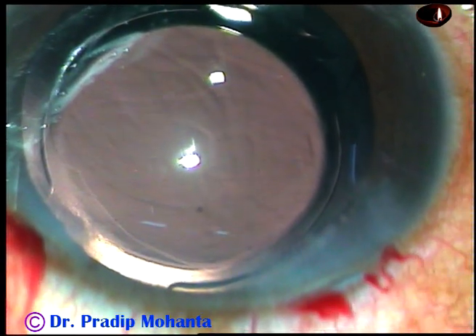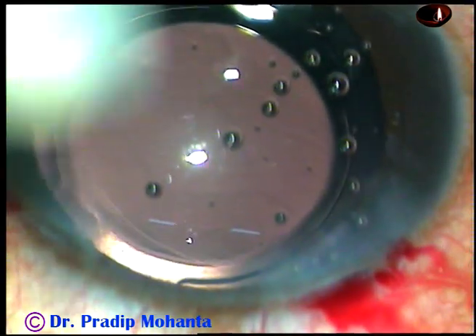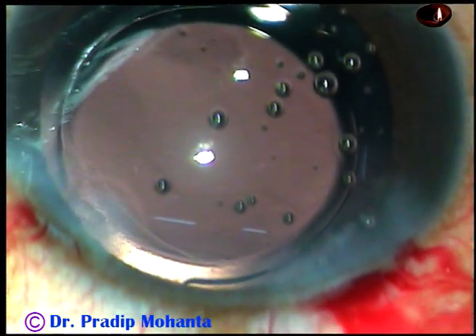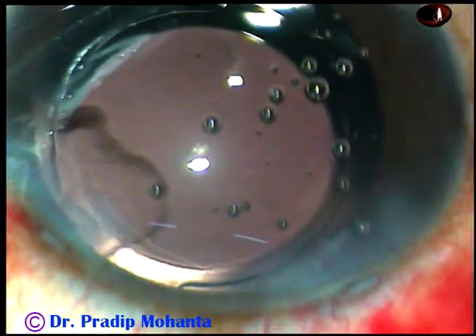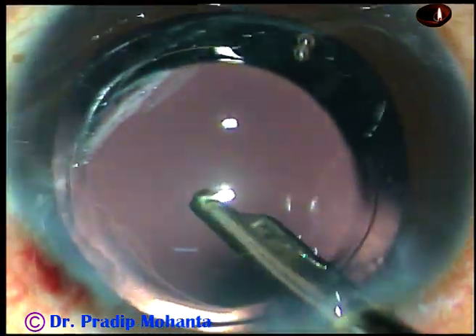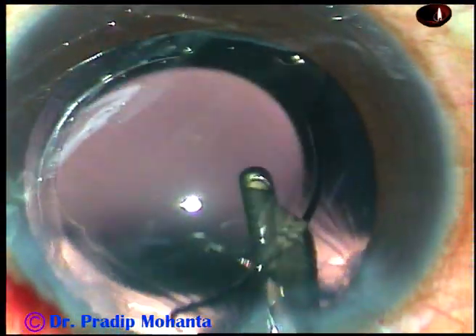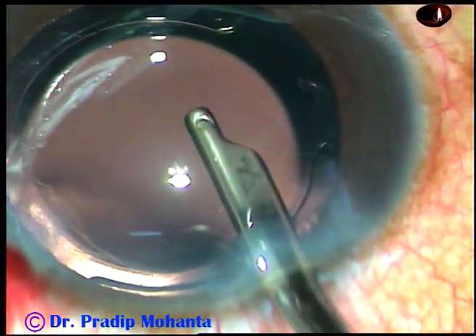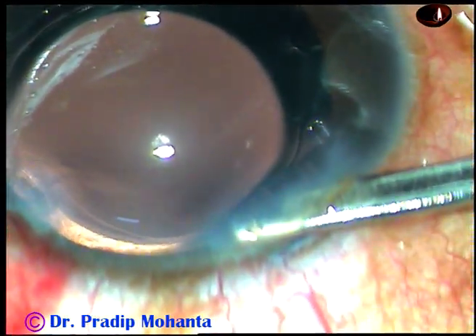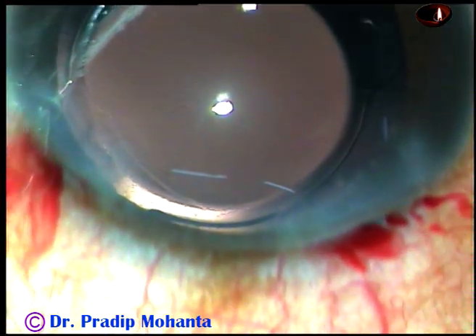This is a bit of moxifloxacin. The side port is to be closed by hydrating the corneal stroma. The main wound has not been stretched, it has been constructed nicely, and it will not require any hydration. This is the final lavage of the anterior chamber. The aspirating port is used for irrigation towards the corneal endothelium, and whatever viscoelastic sticks to the corneal endothelium comes out. All the viscoelastic from the capsular bag is also removed by going behind the intraocular lens. The anterior chamber is nicely formed, and the integrity of all wounds is checked.